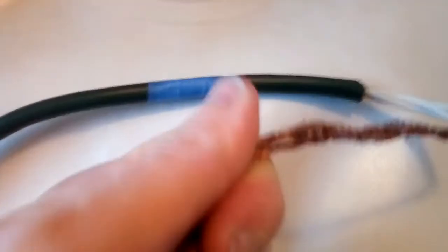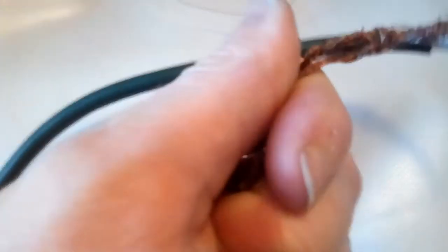Then I leave probably about that amount, just a very small gap right there, just a very small hole, so it'll be tight when it goes onto that oxygen hookup, and then I twist it. I twist it pretty tightly. I don't know how well this is going to work. I'm not that good at this, but I haven't done this many times. So there's a little hole in there.